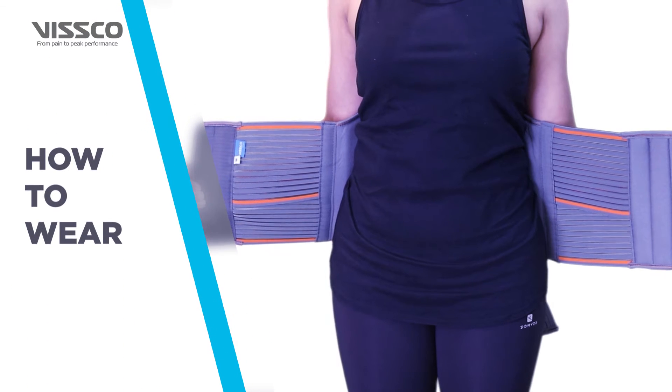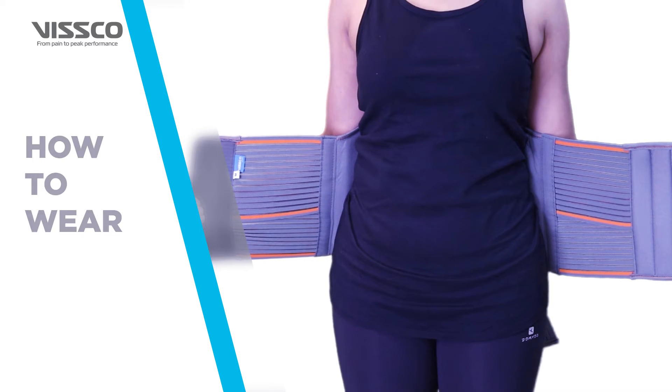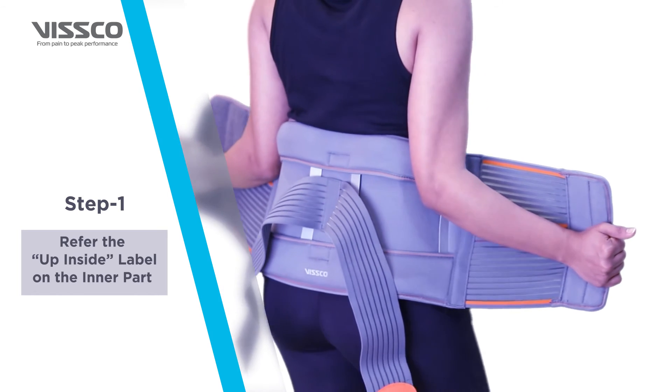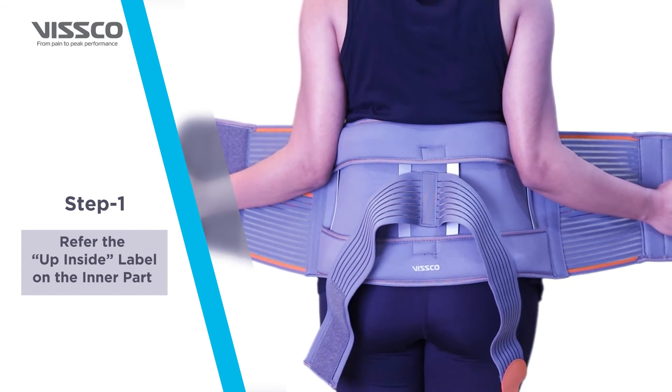Let us see how to wear the product. The Eco-Frame Back Support can be worn in just three simple steps. First, to hold the Eco-Frame Back Support correctly, refer to the up-inside label on the inner part.